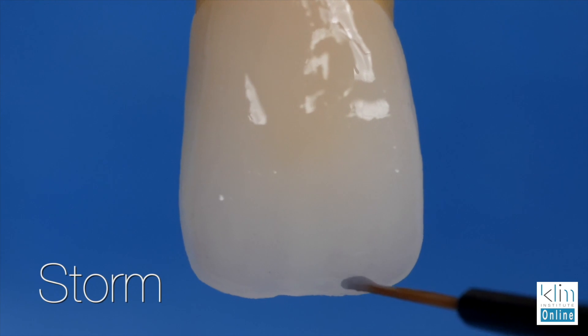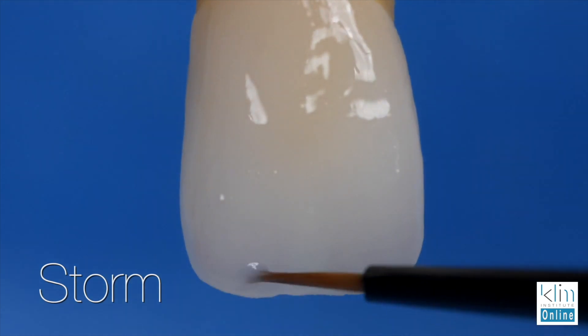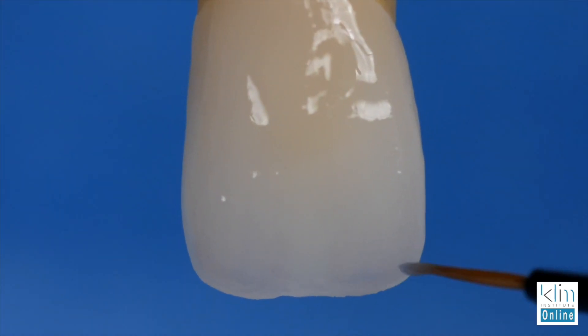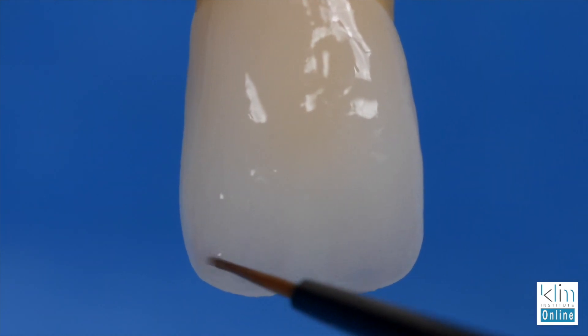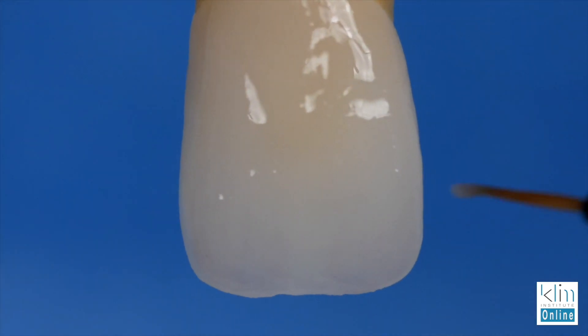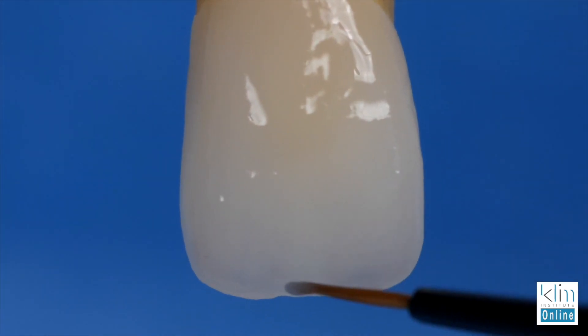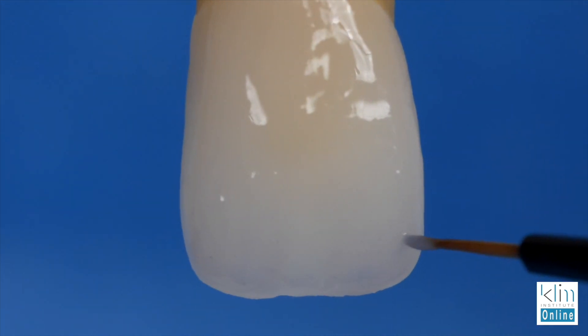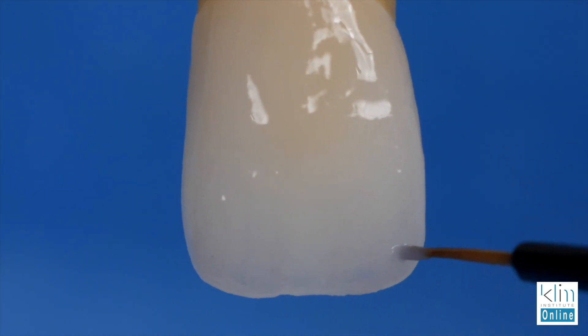Step two is to add the storm. Storm has a little bit of blue in it, and what I've found very effective is that you highlight the smoke with it. Blue can be really intense, so you're going to add it just at the edge of the primary depressions and slightly streak it down from that incisal edge and blend it into the smoke. Most of the time, that's all you need to do. If you're using a ceramic that already has a nice value, you just want to create the contrast and bring the value down. For my veneer cases doing multiple teeth, sometimes I'll just add the smoke and storm and create that incisal effect with those two colors and I'm done.